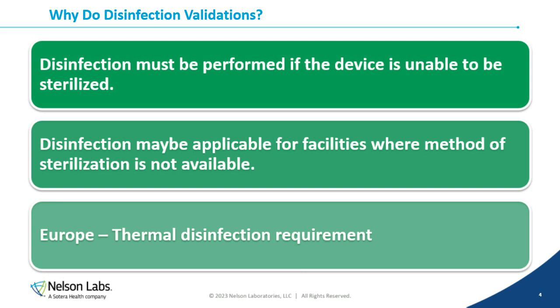And then lastly, in some regions, maybe disinfection is an interim requirement for the processing of your device. Maybe where you're marketing, you need to show that the device can be adequately disinfected even before sterilization, which is what we see in Europe. We see a lot of countries in Europe wanting to see thermal disinfection data before sterilization. And we'll talk a little bit more about that a little bit later in the presentation.